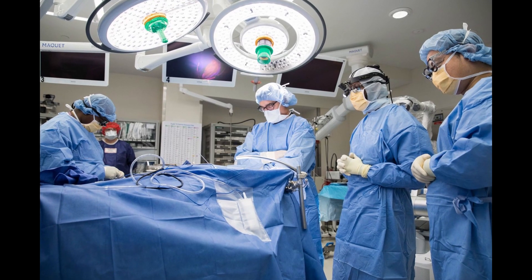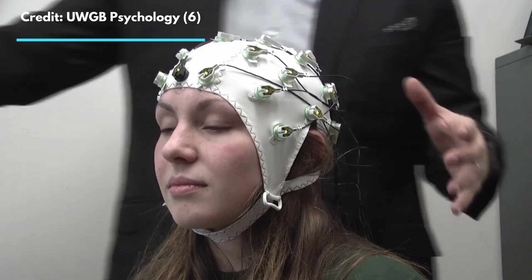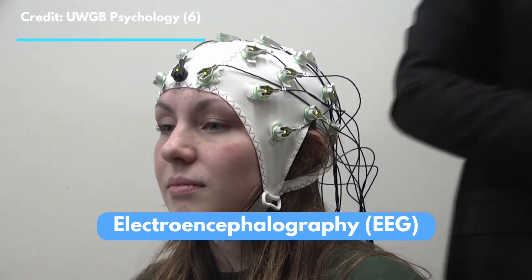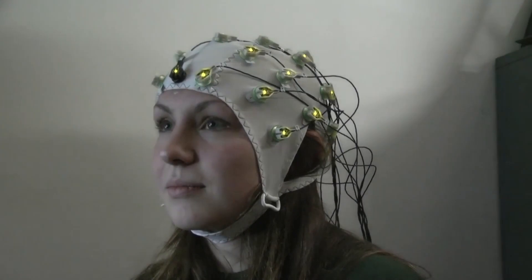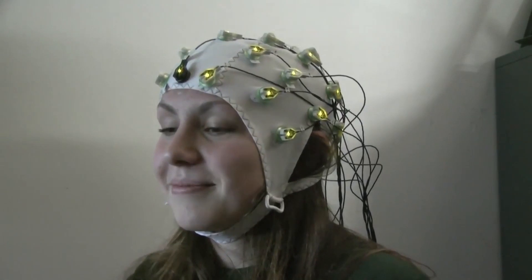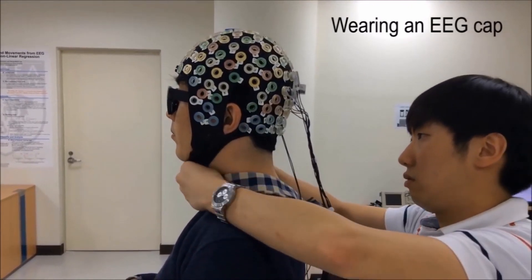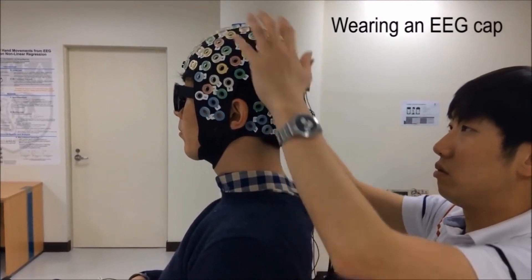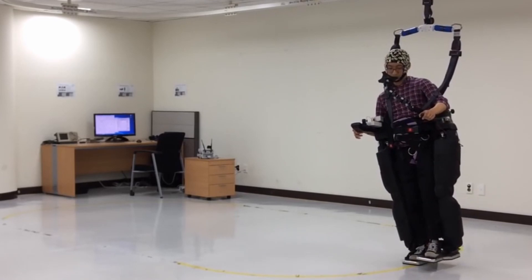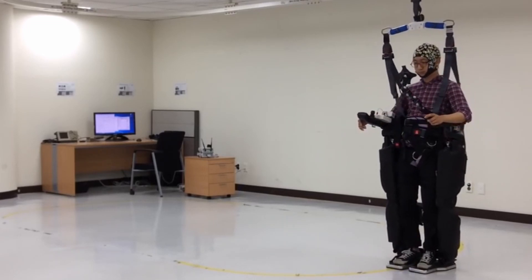There are still many challenges, and you might wonder: do we really need an invasive brain-computer interface? Scientists are working on alternatives — specifically, controlling exoskeletons with EEG, or electroencephalography, a technique to scan the brain that is portable and requires no surgery. You just need a specialized cap. In a 2015 example from Korea University and TU Berlin, a user was able to control an exoskeleton just with an EEG cap.